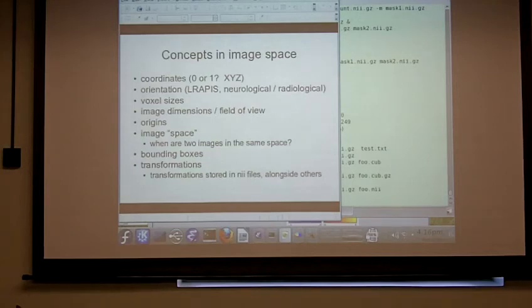So when you're talking about where you are relative to the origin, the number of voxels and the number of millimeters are different. Typically, it's fairly unusual to talk about the origin in voxels, except in the one specific case of bounding boxes, which I'll get to a little later.